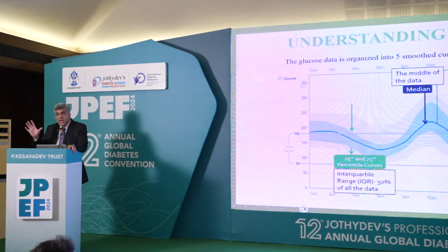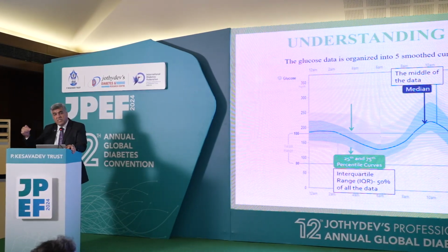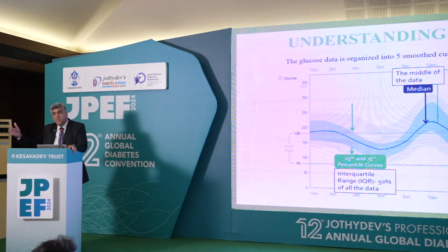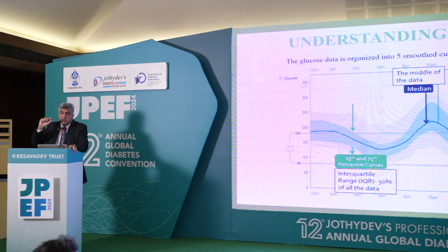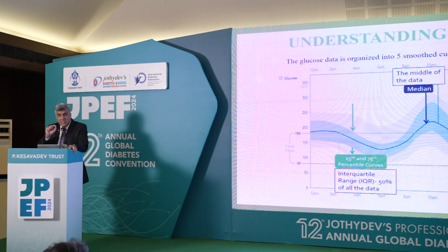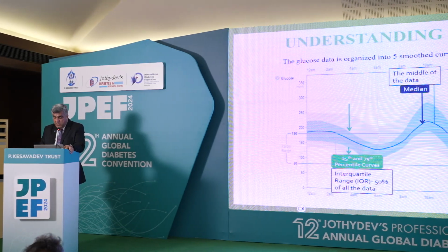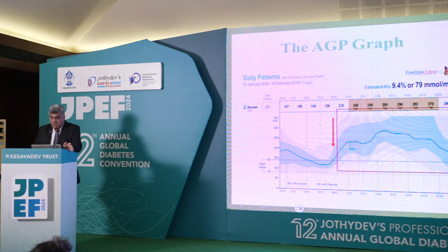So you watch that, and that's where you will tell the patient that, on a certain day, when you see the individual day data, you probably ate late or had that extra midnight snack, and see how your sugars went up. But you don't change the therapy based on the variability of the top and bottom shaded portions; essentially you do it on the basis of the median and this blue shaded portion from the 75th to the 25th percentile. So the graph is a modal day.